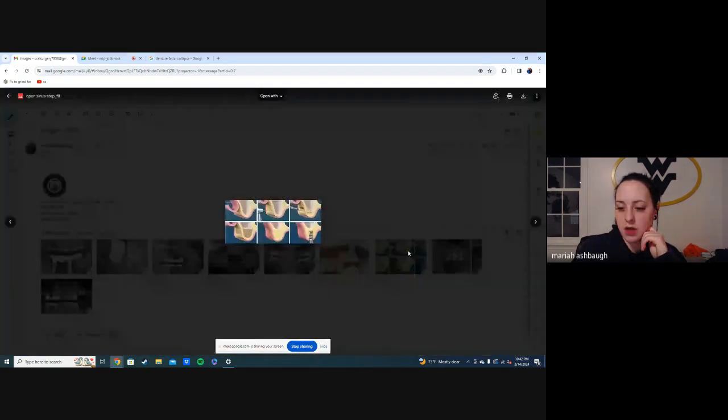So you can see here, if this were the front of the face, this is more like what we do. We make a little indentation. Then this piece of bone here, you use it to push that in. So you can see this little membrane layer here. I like to describe this as a hard-boiled egg.